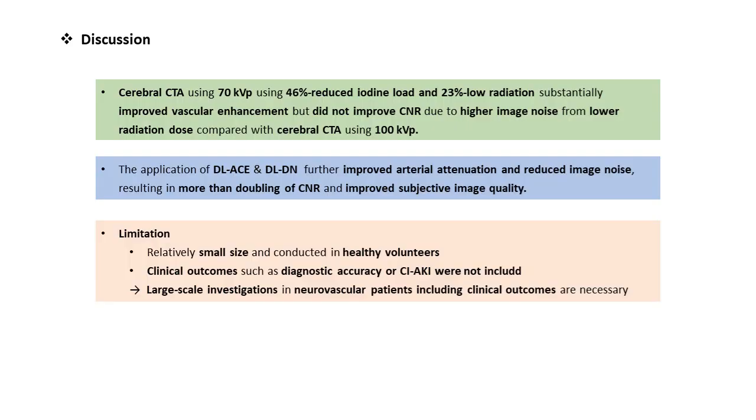In summary, cerebral angiography using 70 kVp with reduced iodine load and low radiation substantially improved vascular enhancement but did not improve CNR due to higher image noise from lower radiation dose. However, by applying the DLACE and the DLDN, we can substantially improve arterial attenuation and reduce noise simultaneously, resulting in more than doubling of CNR and improved subjective image quality.